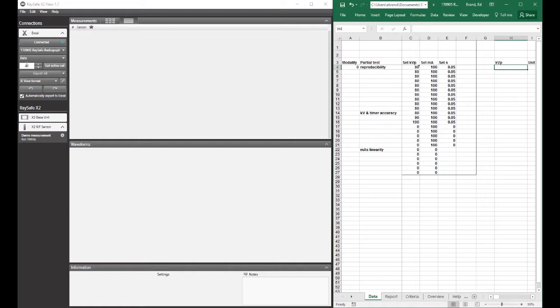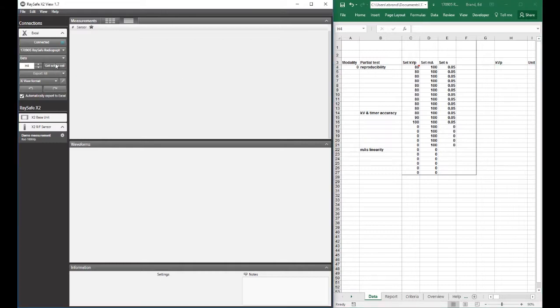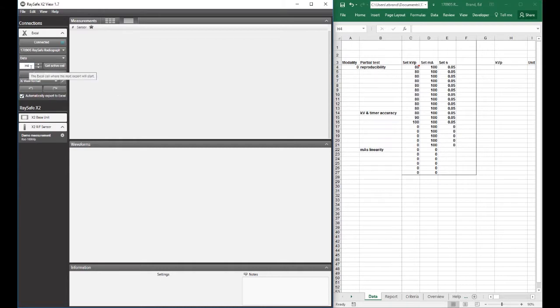But first to do that, I either need to type H4 as a starting cell, or since I have selected cell H4, I can get active cell. And it automatically puts it here, showing that the starting cell is going to be H4.